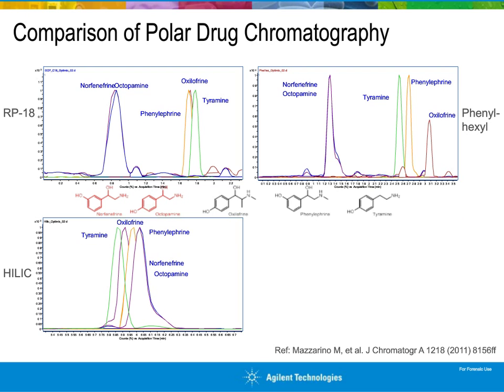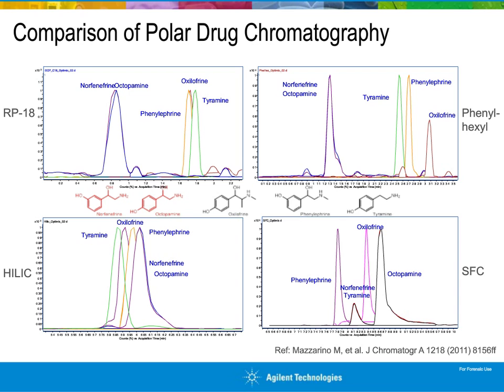And if we look at this on an SFC, you can see that this is well separated on an SFC. The first 3 pictures here have been basically reproduced based on a paper from the Doping Control Laboratory in Rome. And I used the SFC at a university in Berlin to run the very same compounds to see how this compares.